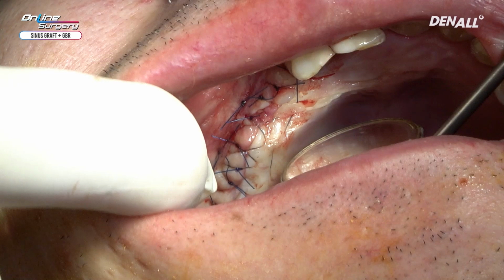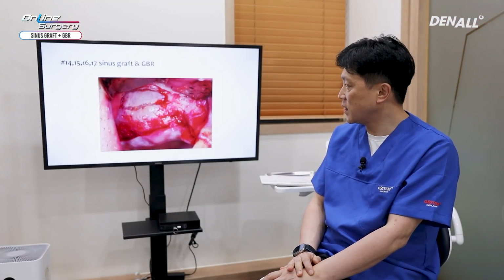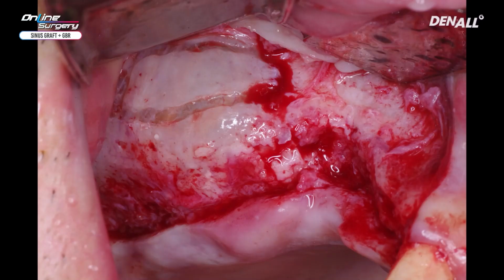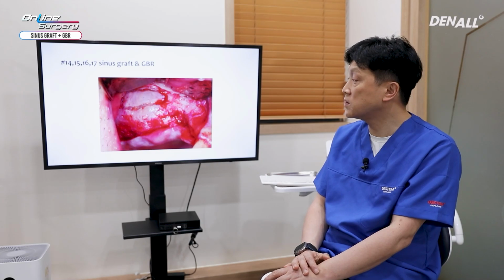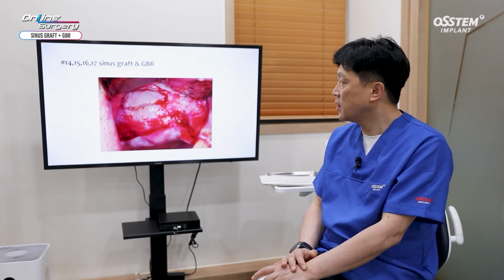Did you enjoy the video? Let's look at the images taken during surgery. As shown, the lateral wall of the sinus was extremely thin, almost to the point where osteotomy was unnecessary. Periosteal elevator and other tools that can be used in such circumstances can damage the sinus wall. You need to take utmost care.